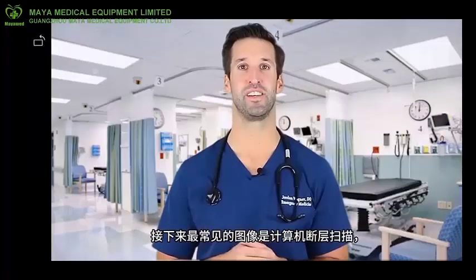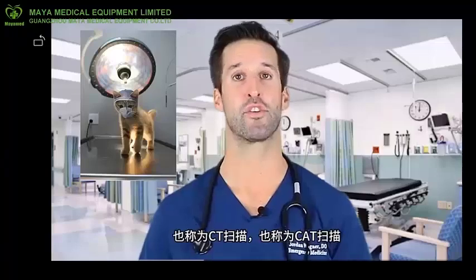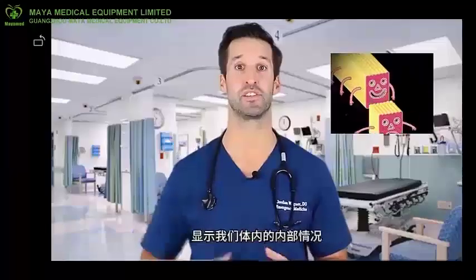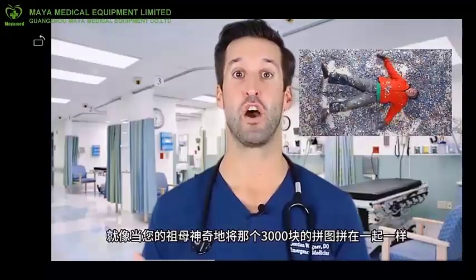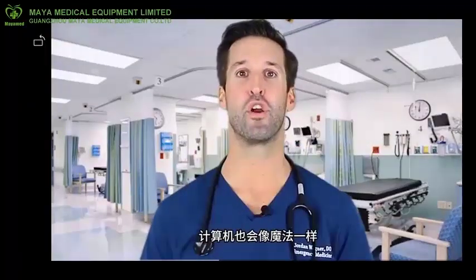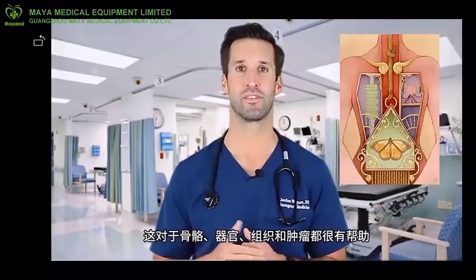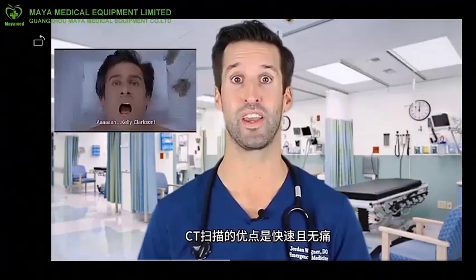Next most common image is the computed tomography scan, also known as the CAT scan, also known as a CT scan. The CT scan uses hundreds of X-rays to produce cross-sectional images that detail the inside of our body. Just like when your grandmother magically puts that 3,000-piece puzzle together, voila! The computer also magically puts hundreds of X-rays of images in 3D form. This is good for bones, organs, tissues, and tumors. The advantage of the CT scan is that it's quick and painless.